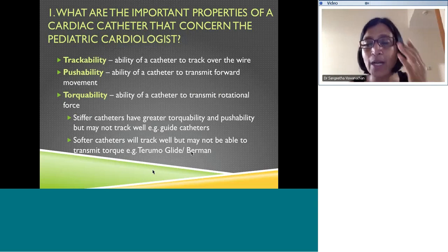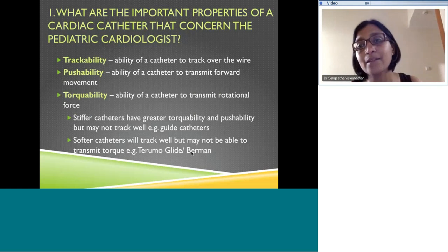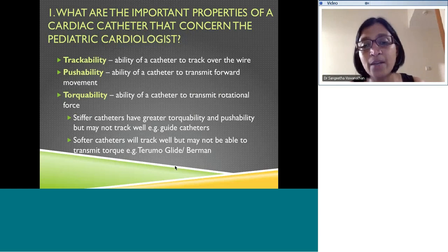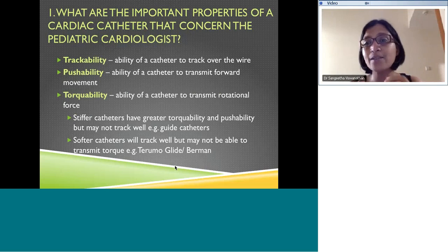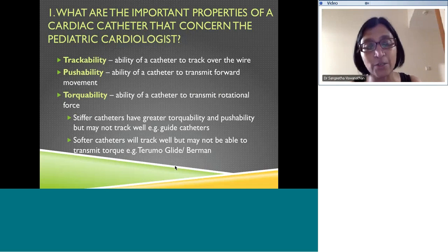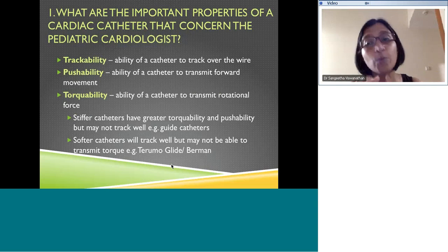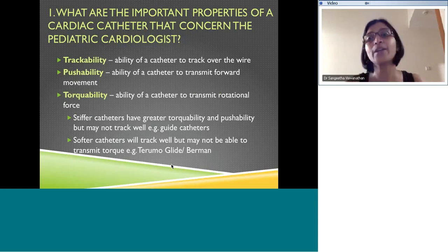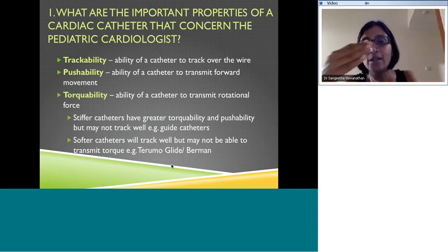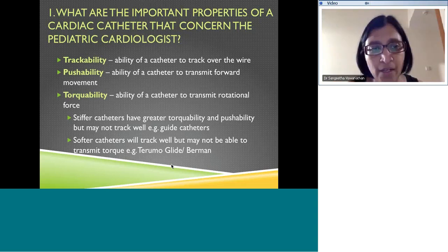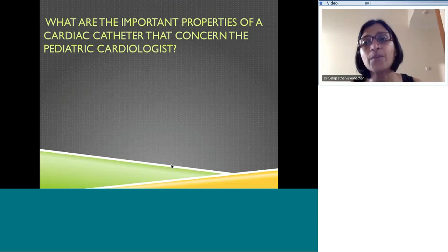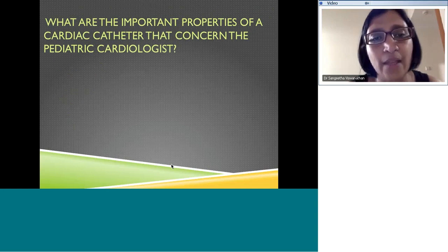Softer catheters like the Terumo Glide cath, which is the black catheter, can be used over a wire usually. The Berman is another catheter which is very soft — it's a balloon-tipped catheter — and it's not a very stiff catheter. If you try and use the Berman without the balloon, it's very difficult to get it to move forward; it has a tendency to curl up in a chamber. These are some of the basic characteristics of the catheter.